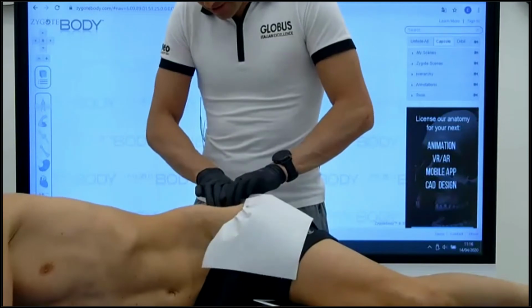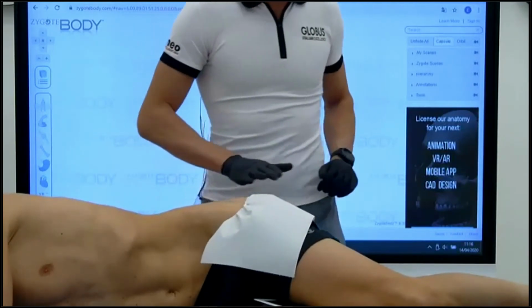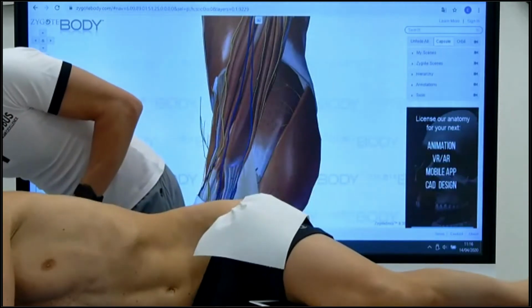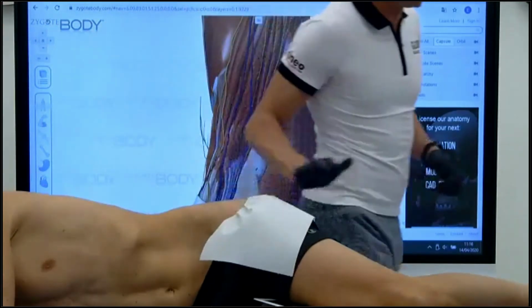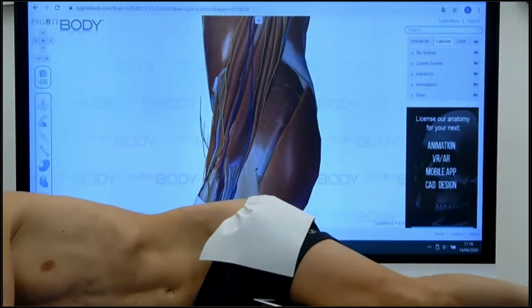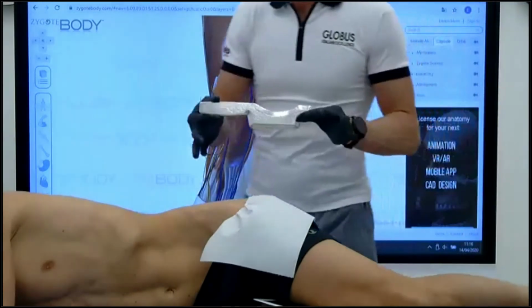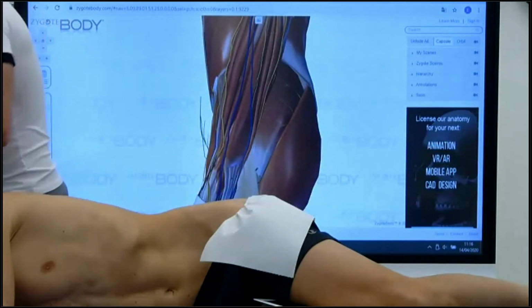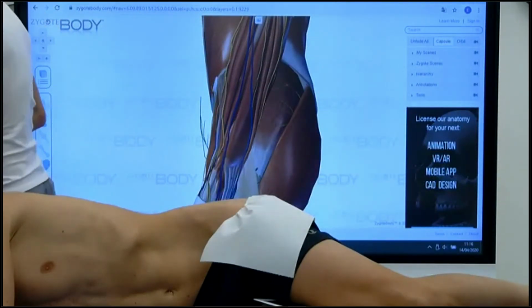For these bundles here, I can also use the Dia Blade large. As we said before, we need to prepare the tissue with a capacitive mode, and then we can start with the Dia Blade large, this one. So, a few seconds with the capacitive.